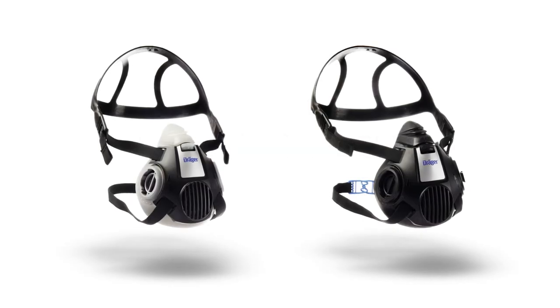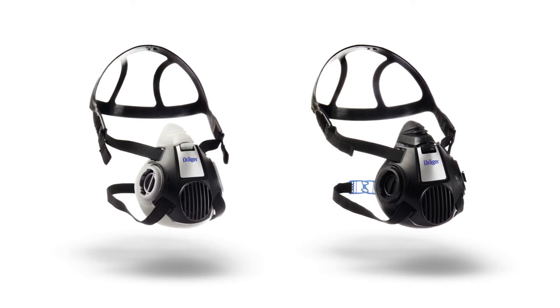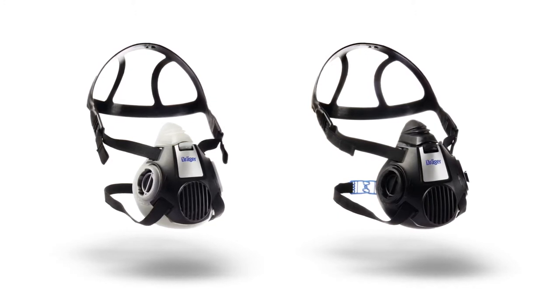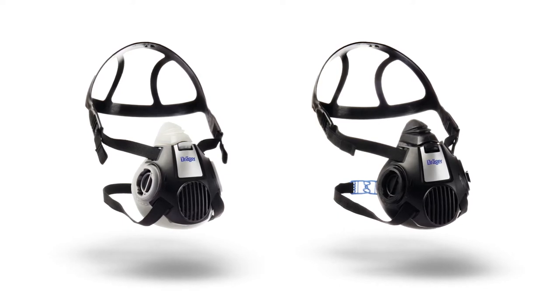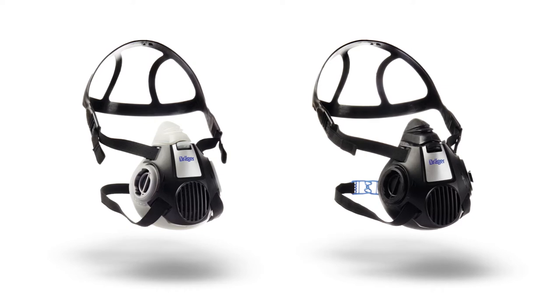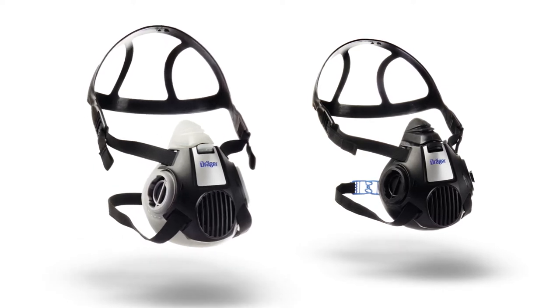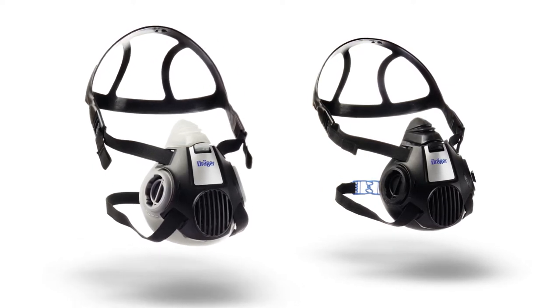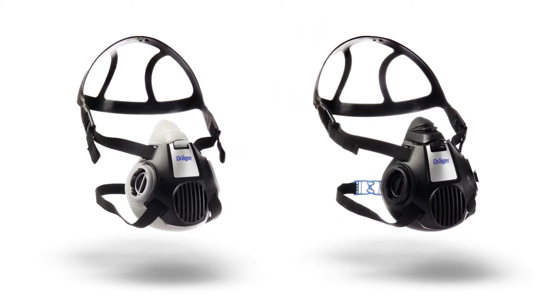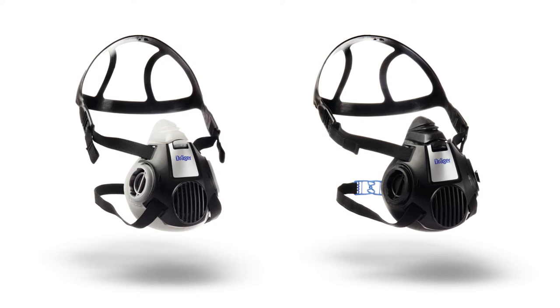The Half-Mask series Draeger Explore 3000, in combination with appropriate breathing filters, protects your respiratory system against harmful particles and/or gases and vapours. Two Half-Mask versions are available: the low-maintenance, cost-effective Draeger Explore 3300 Half-Mask, or the Draeger Explore 3500 version for long-lasting protection under tough conditions.